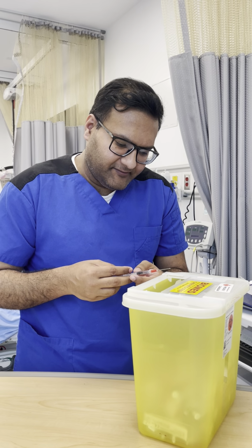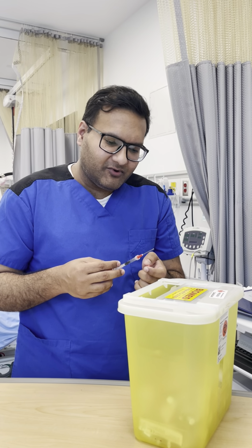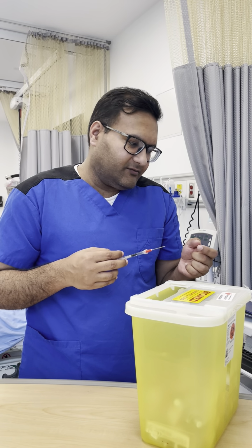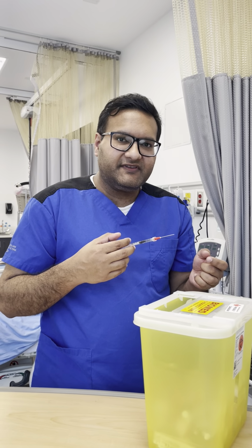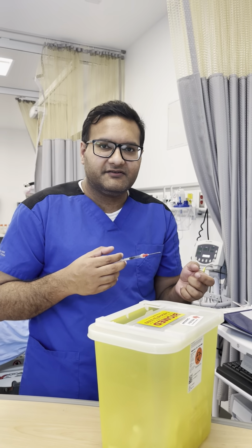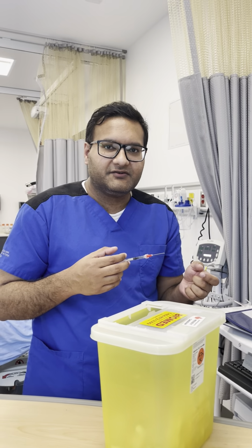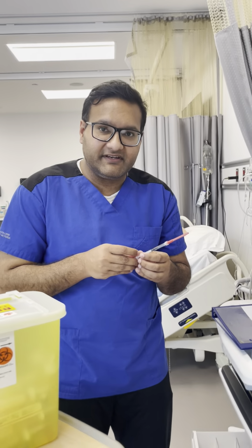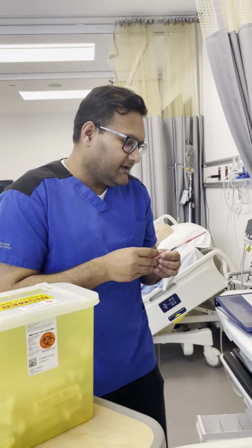So in real life, I've had a bubble that is a little bit harder to remove. So what I would have done would be to dispose of this, and then draw new air, and then try to draw out from a new vial, and ensure that my bubbles are gone. After doing so, I would ensure that I have drawn exactly 0.6 ml as part of my calculation. And once done so, I will now perform my third and final complete check.